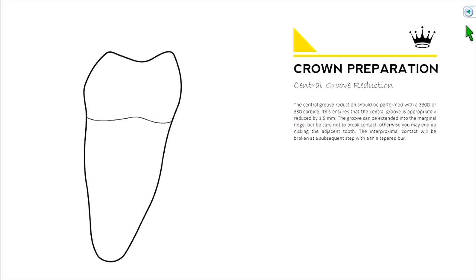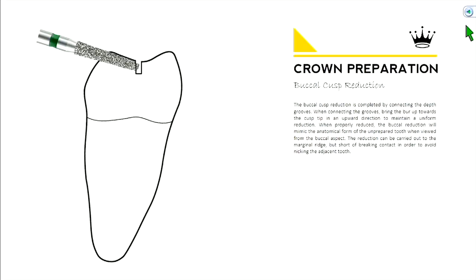First step is to reduce the central groove — take a burr and make a little groove right in the middle. This is important because your opposing cusp, your maxillary cusp, is going to hit right in that central groove. So you want to make sure you have enough thickness of material there. Then you uniformly take down your buccal cusp — orient the burr sideways, drop it down, and notice how it follows the angle of the cusp.